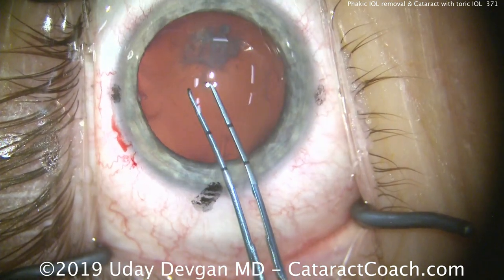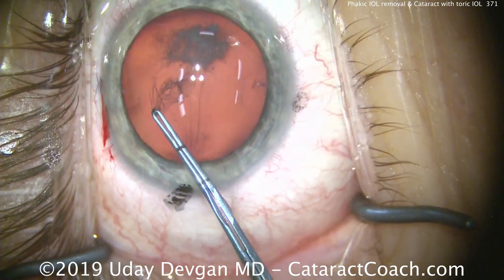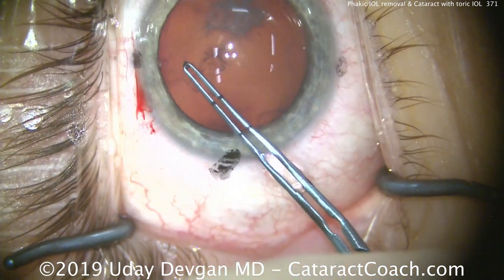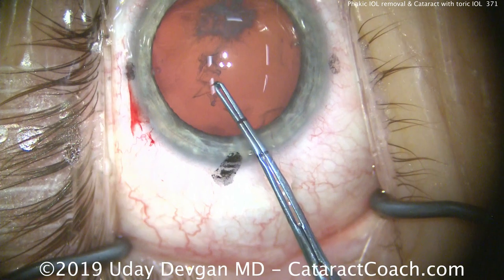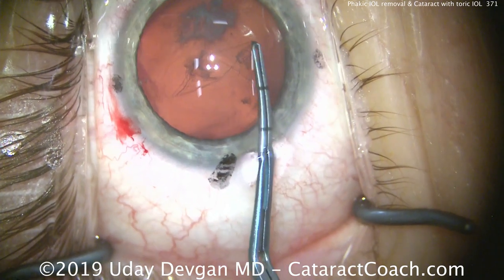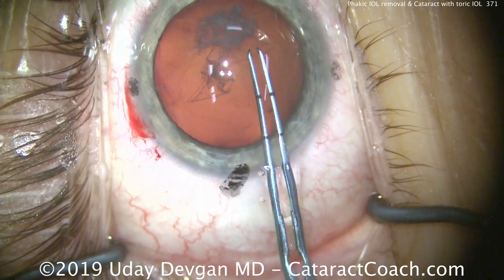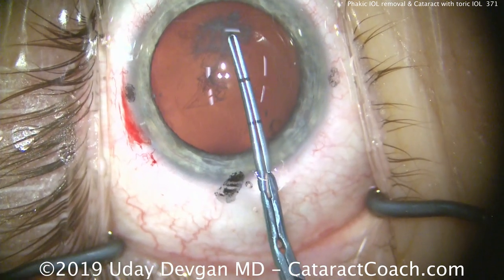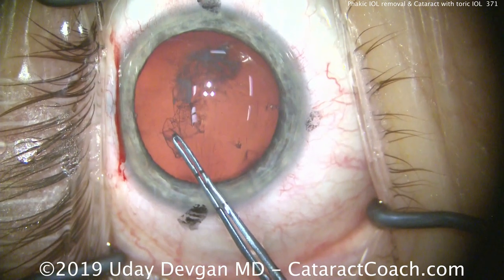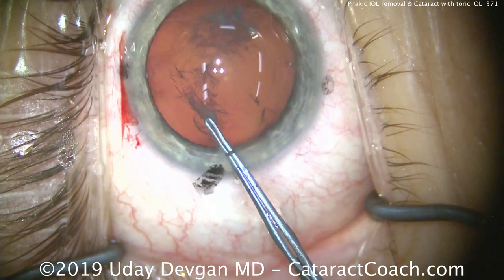For a toric lens, we want a nice round capsulorrhexis of about five millimeters in diameter, and we'll tear that here. When we come across to that big white opacity, it may be fibrous, so this part of the capsulorrhexis requires extra care. When we reach that opacity, we must ensure the rhexis proceeds normally — there'll be a little extra resistance, but we're able to complete it. You can see the back side of the anterior lens capsule has a lot of that white opacity. We have a very nice rhexis there.